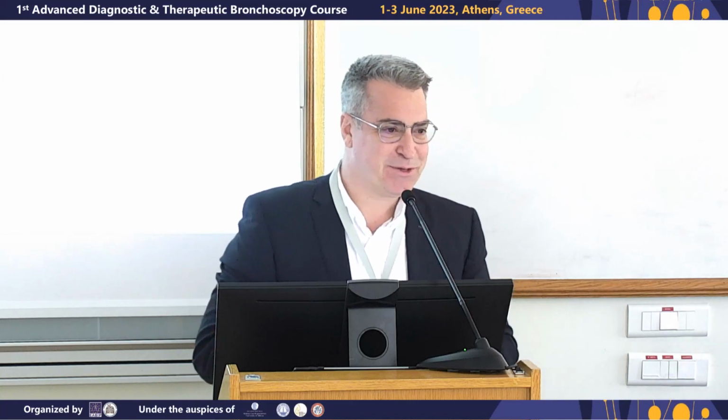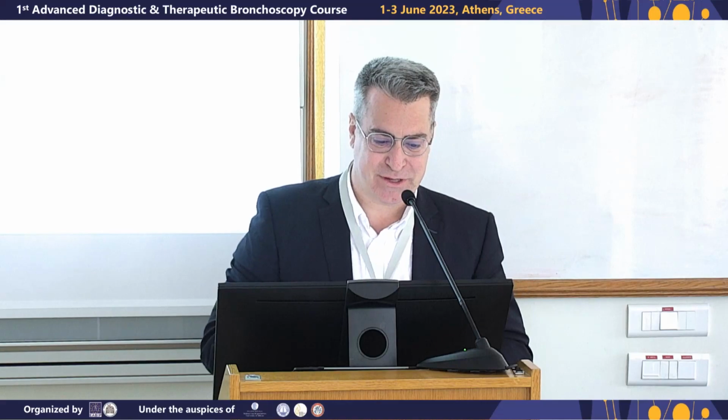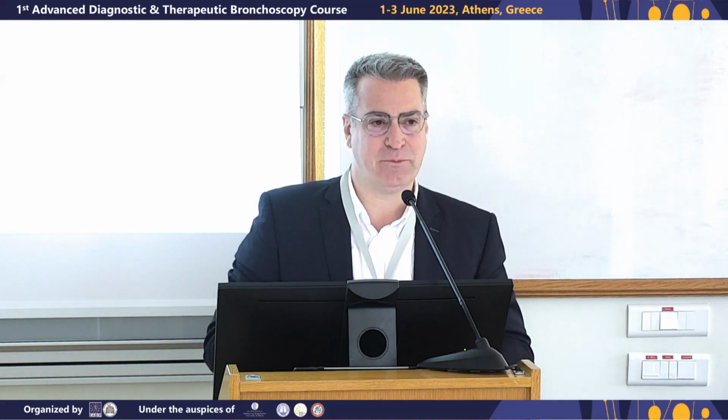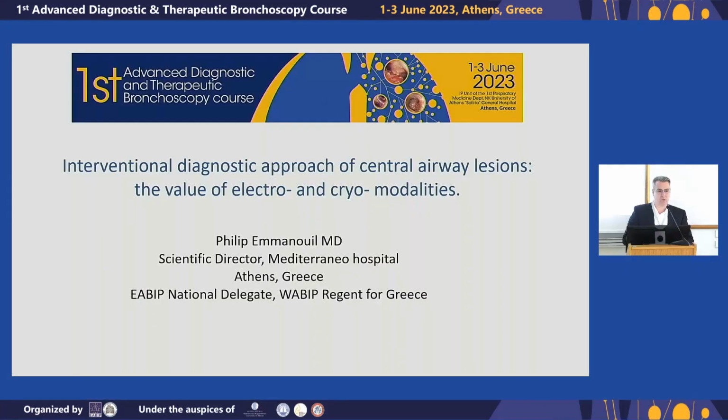to have such a talk, because we are going into the essence of the seminar. We use electro and cryo modalities in an interchangeable way in order to achieve our goals, which are to take sufficient diagnostic biopsies, but as well treat our lesions with therapeutic purpose.